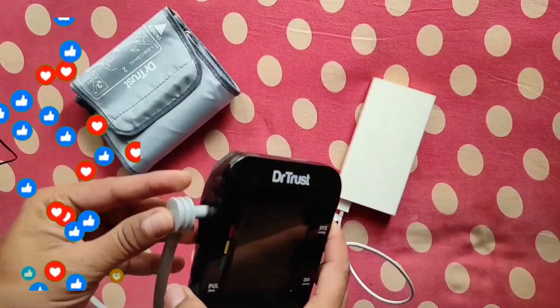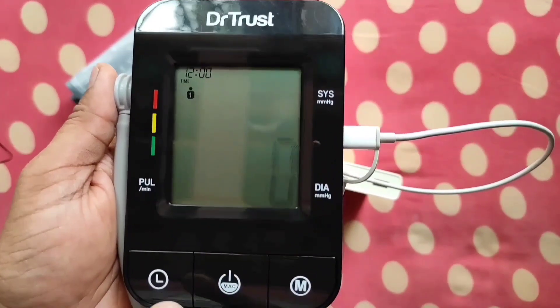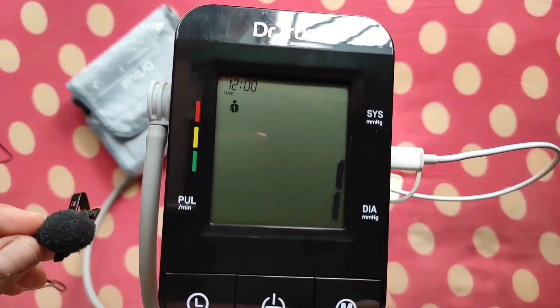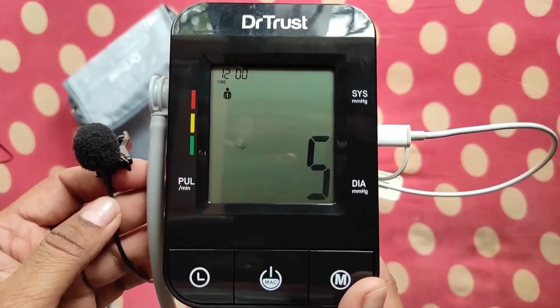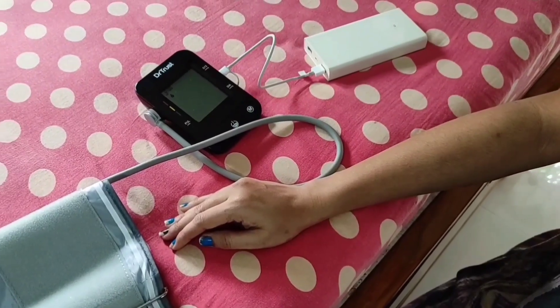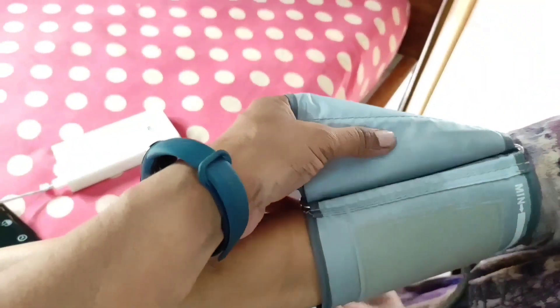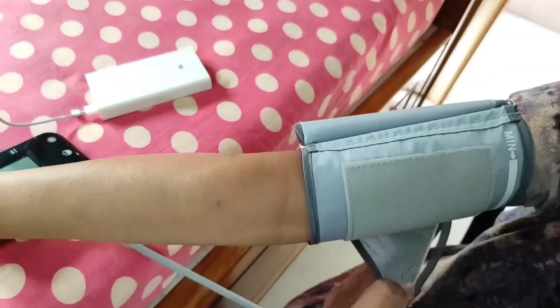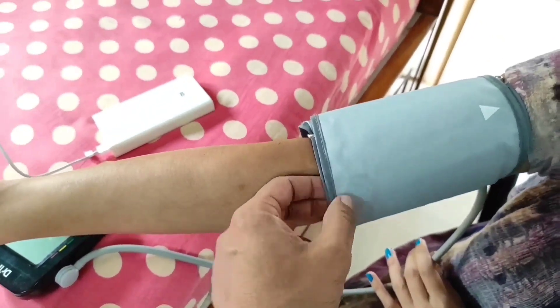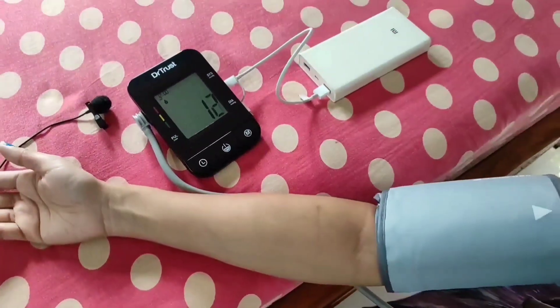Now let's insert the air connector into the air outlet properly. Press the power button and you can see all digits become visible, then it starts inflating the cuff. The increasing digits on screen represent the increasing pressure in the cuff. If you get an error, it means you have not fastened the cuff on your arm. For a correct reading, you must first fasten the cuff properly on your left arm as per the instructions, with the cuff position at the same level as your heart. Then press the power button and it will measure your BP in standard mode.